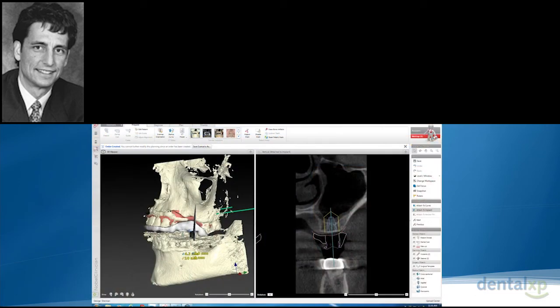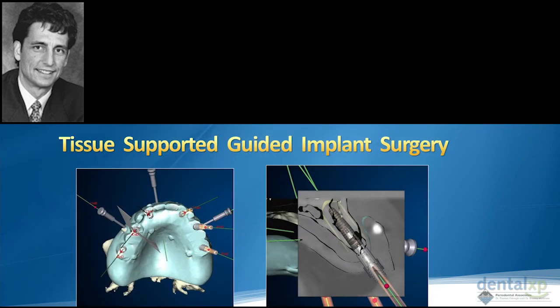The treatment planning, again, allows everybody on the team to understand what the limitations are. When you have poor quality bone or we're utilizing sinus grafting, that's when we start looking at the length of the implant and discussing diameters and numbers and splinting. Those types of discussions can all be vetted beforehand.